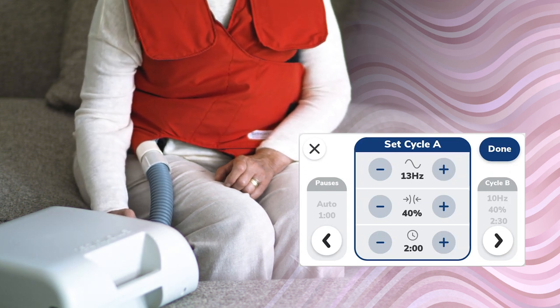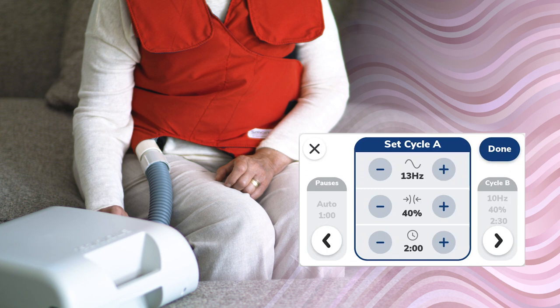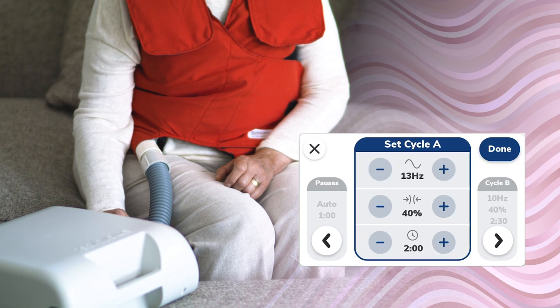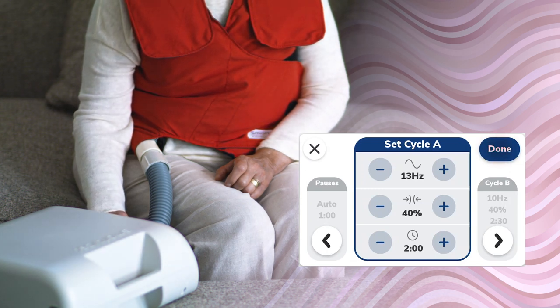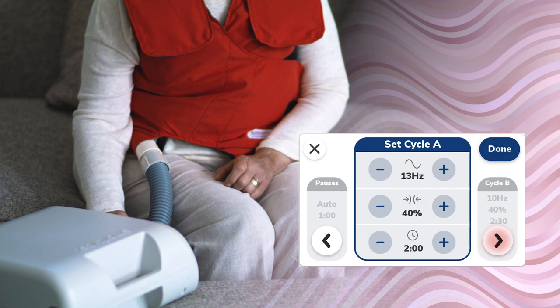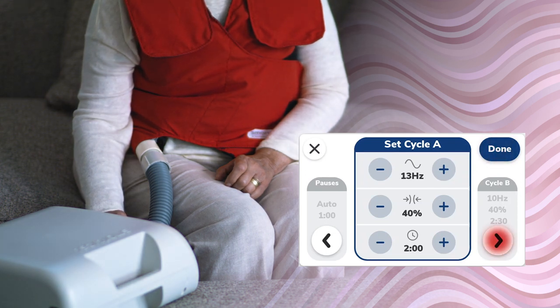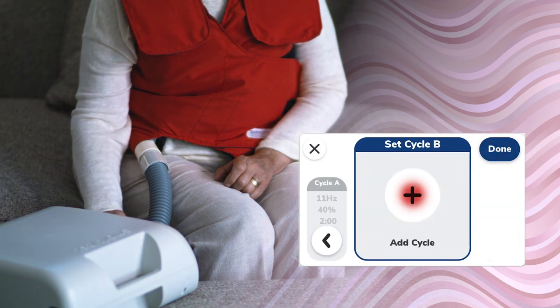After adjusting the cycle selections, determine if more cycles are desired. If no further cycles are needed, tap the Done button to save the program. To advance to additional cycles, tap the next arrow.